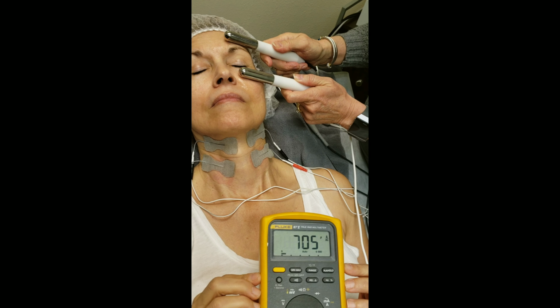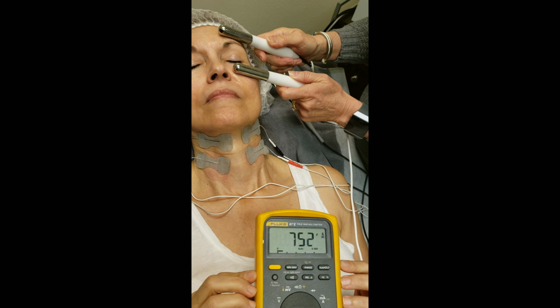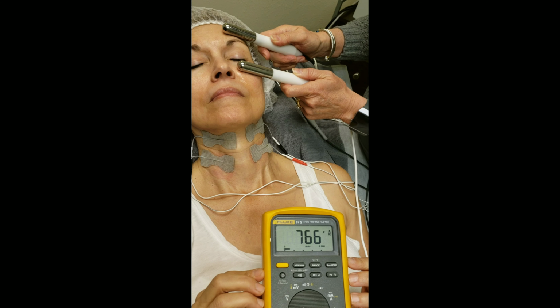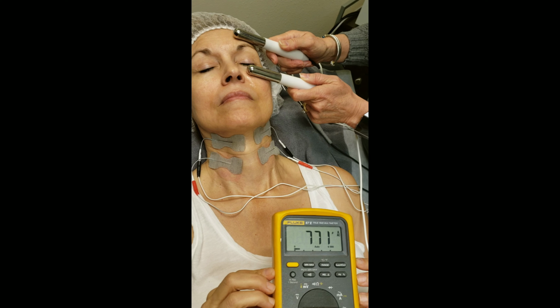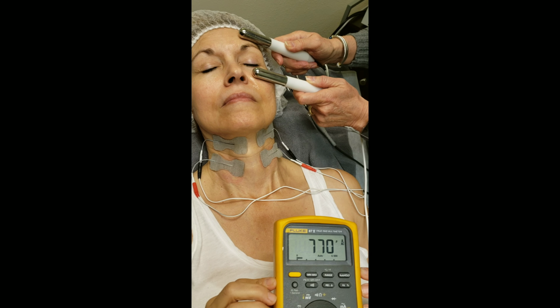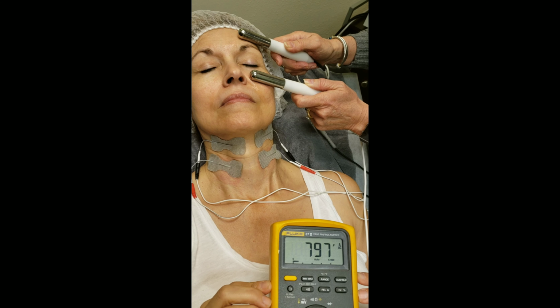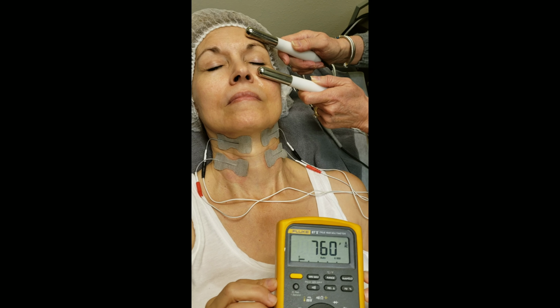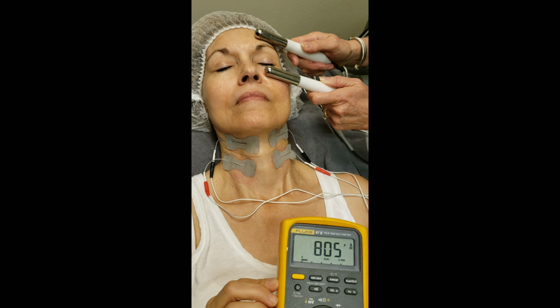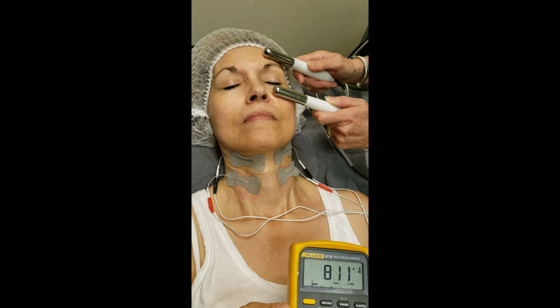Well, look at that. We are getting about 750 microamps for this particular client. Now, this machine has a skin impedance regulation system that monitors the density of the skin in relation to the skin surface area with the probes and the pads being treated, to output perfect levels based on a complex algorithm that will deliver the amount of signal to the destination tissue.